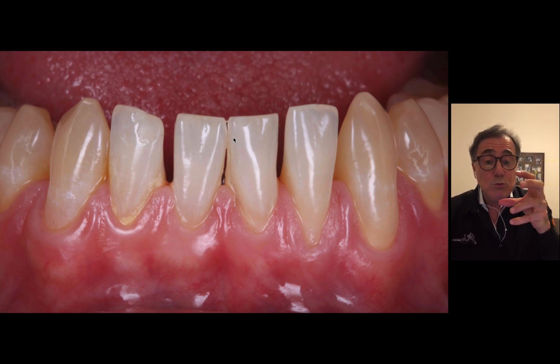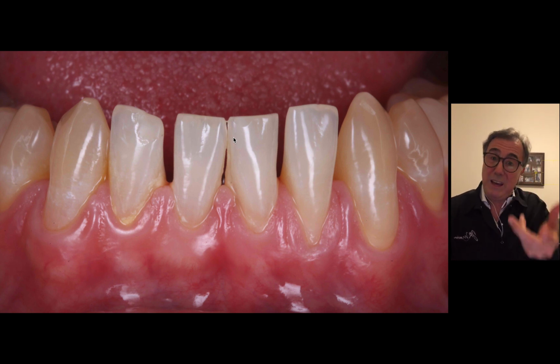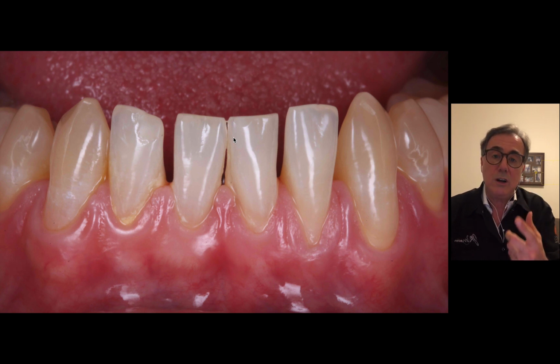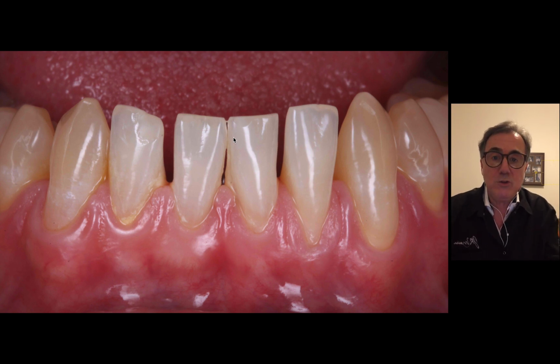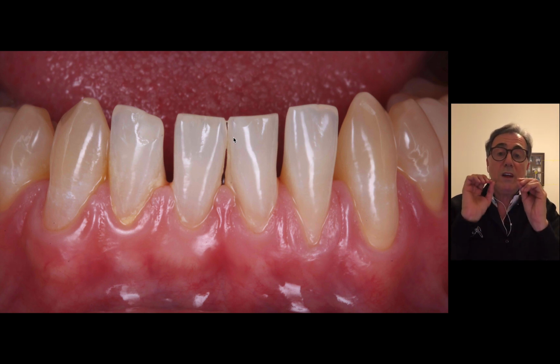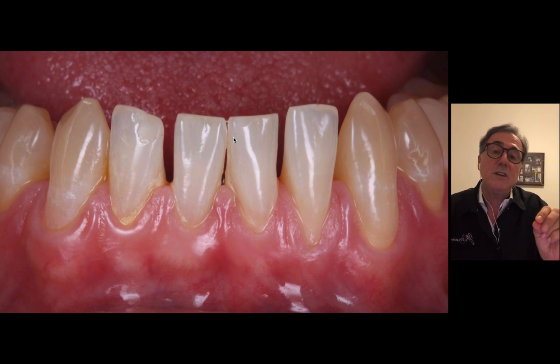Okay, so to resolve this case, we're going to use a special matrix, made by an American company called Bioclear. The Bioclear matrices, there are several types of them, but there's a special one called the BT, which stands for Black Triangle Matrices, which can also be used to close diastemas. So we're going to use those matrices along with a universal composite, which is called Filtek Universal Composite by 3M.